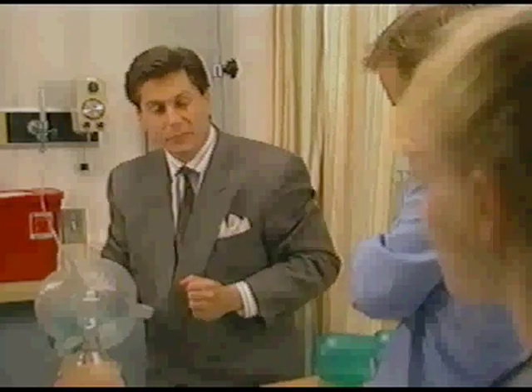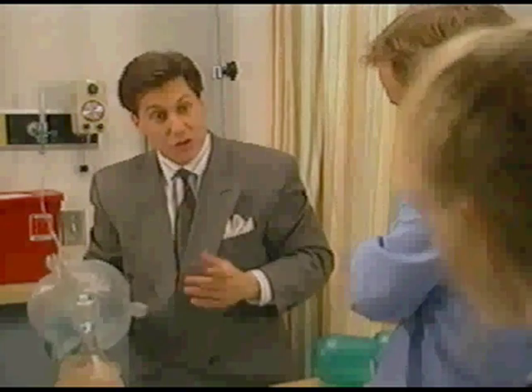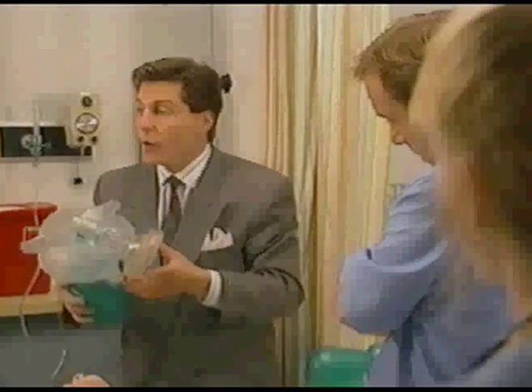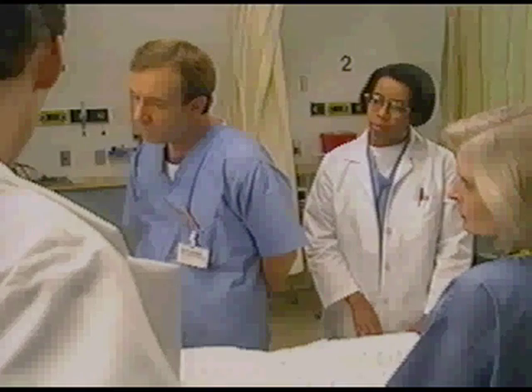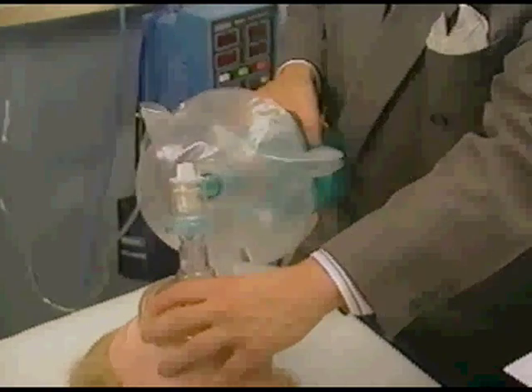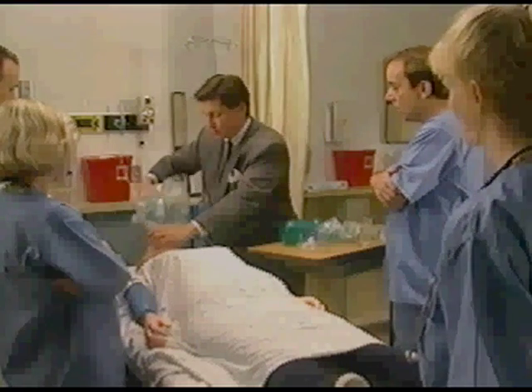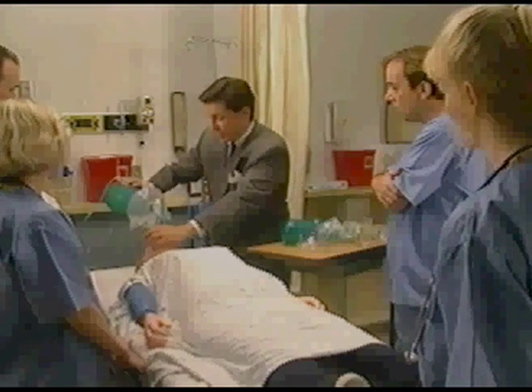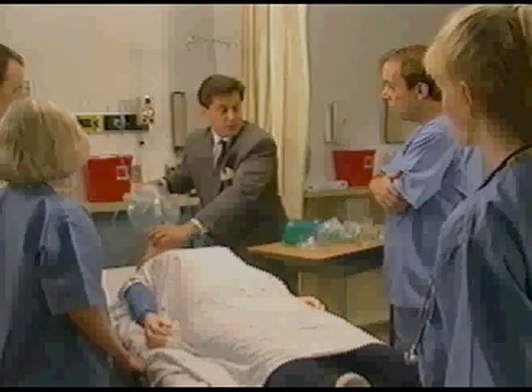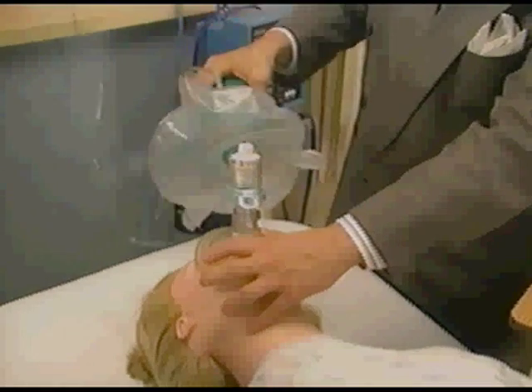Does that material ever get torn? The reservoir is made out of urethane, so it's almost impervious to tears. When we're done here, I'll pass the bag around so you can all see for yourselves. BagEasy has two 360-degree swivels, so I can change sides without even disconnecting. And it has a one-piece flex tube in case I get caught in a crowded corner — I can provide uninterrupted ventilation even in the tightest corner.